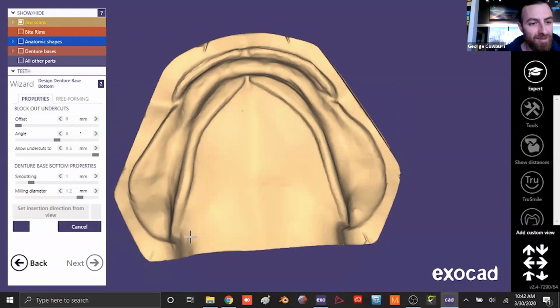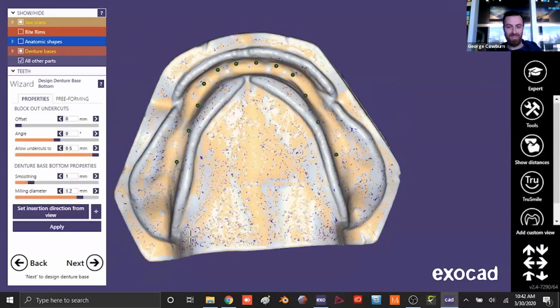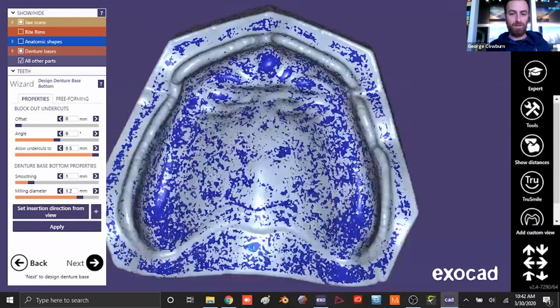Great. And one more we had, when selecting the teeth, there's a number in red or green. What is that number indicating? Hopefully that's tooth for you.